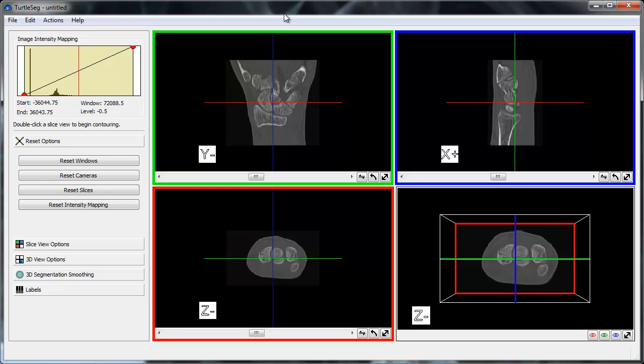I've preloaded the wrist CT volume image that is included with TurtleSeg. In this walkthrough, we'll segment the radius bone of the wrist.